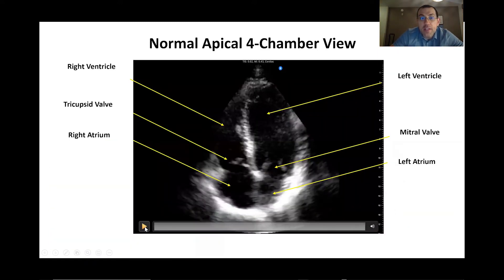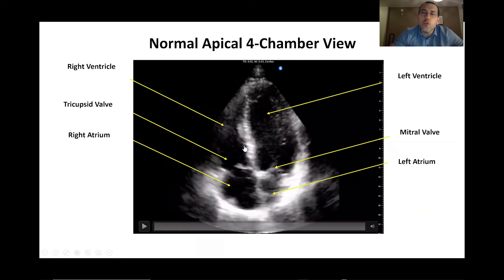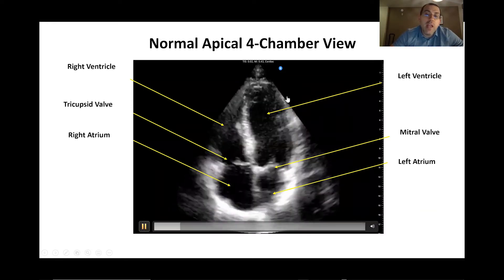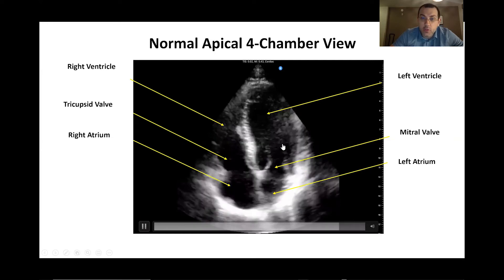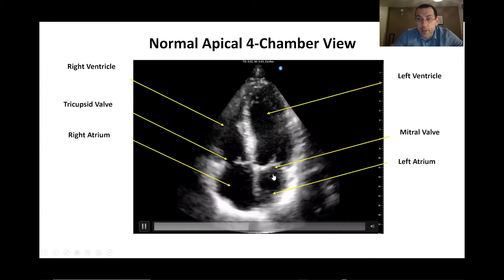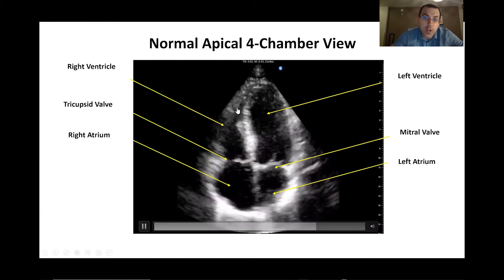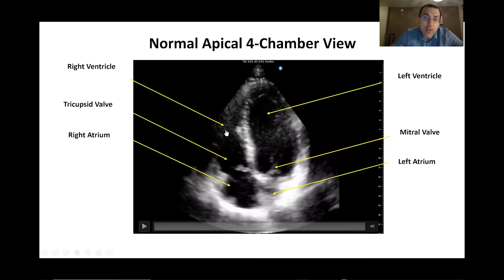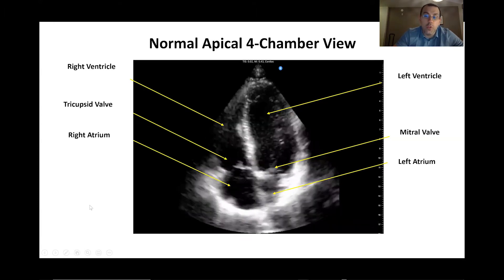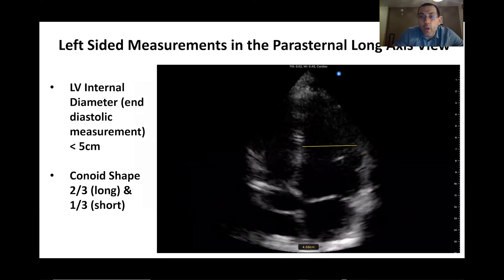Here is your normal apical four-chamber view live. Here we have the left ventricle, and the left atrium down here. If we watch closely, we have the mitral valve opening and closing. On the right side of the heart — the left side of the screen — we have the right ventricle, the tricuspid valve, and the right atrium as well. This is what a normal view looks like. Now let's delve into some of the details of what we're going to look for.